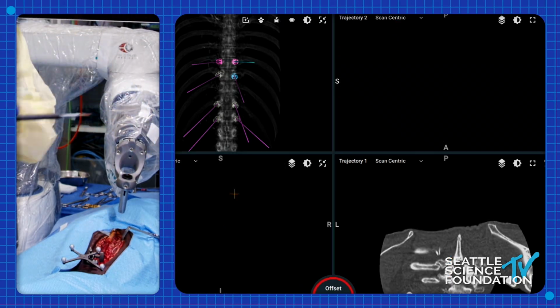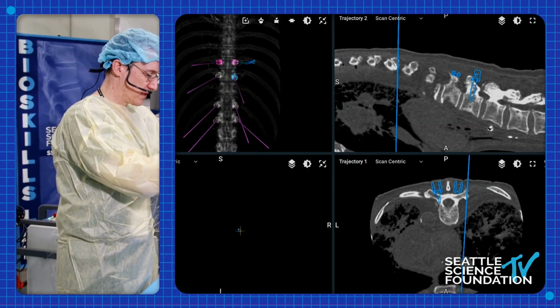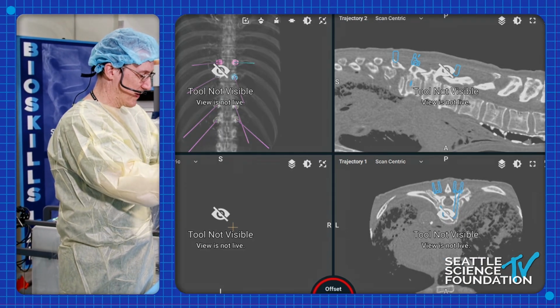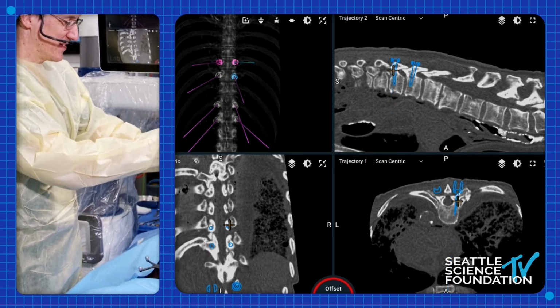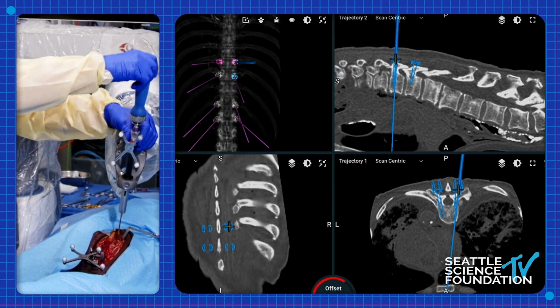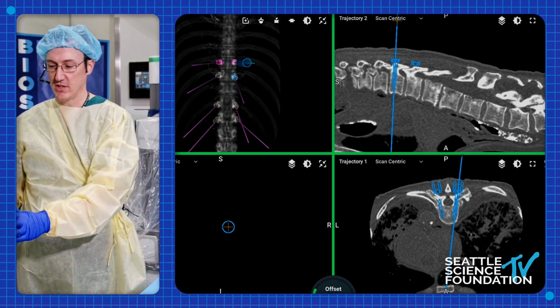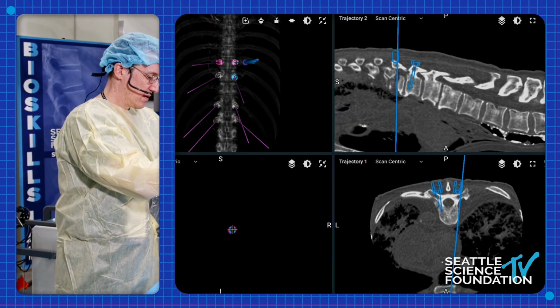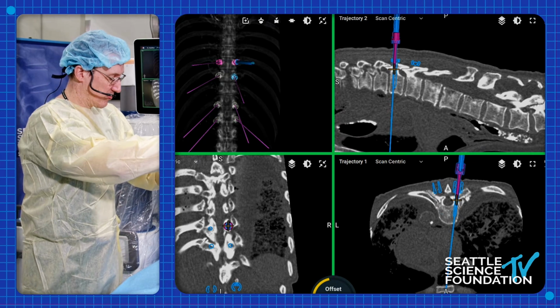All right. Typically, I do tap my screws, and I usually do this under my own power, and that is my bicep. And in this case, when we're dealing with bone that we're considering osteoporotic, I will usually just tap enough to get the screw engaged, and then we can place our screw down into the hole that we've previously made.